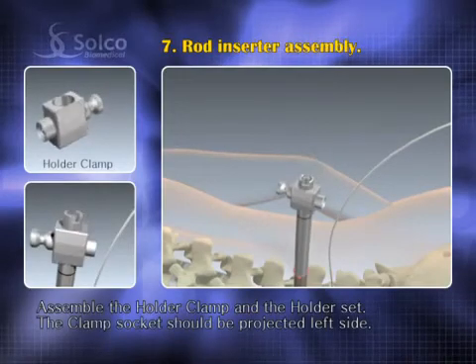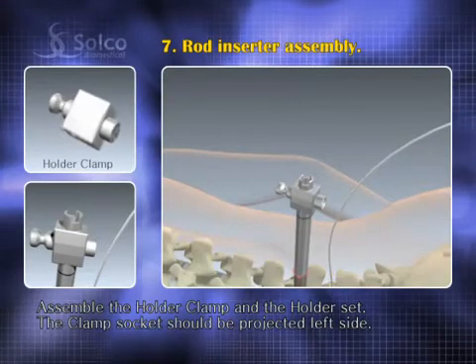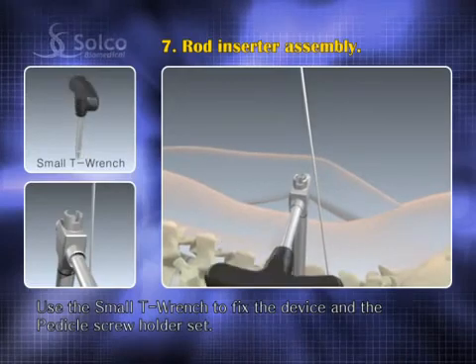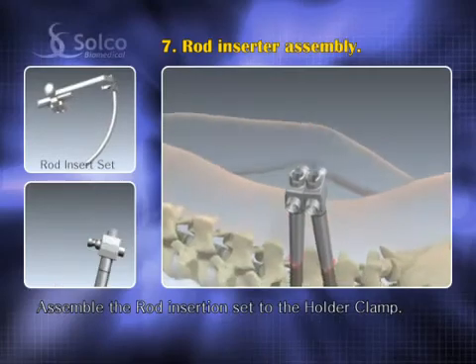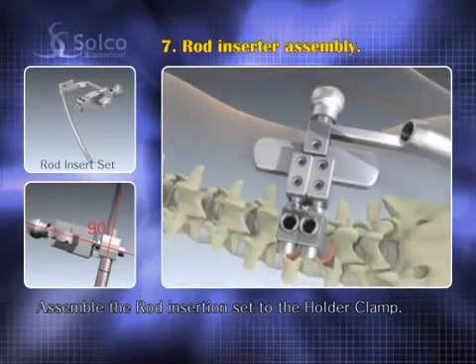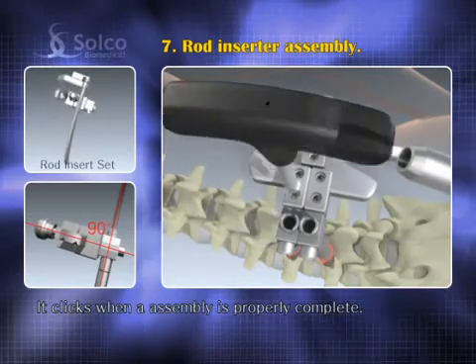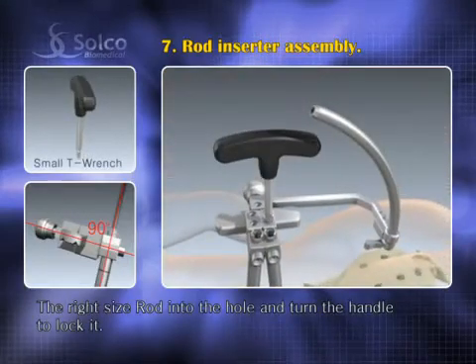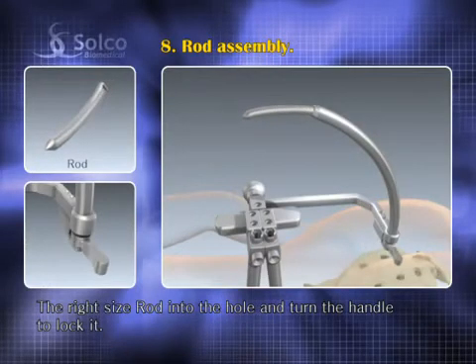Assemble the holder clamp over the holder set and place the projected socket of the clamp to the left. The small T-wrench is for fixing the device to the pedicle screw holder set. Assemble the rod insertion set to the holder clamp and engage its socket to the clamp. It clicks when assembly is properly complete. Put the right size rod into the hole and turn the handle to lock the rod tail.